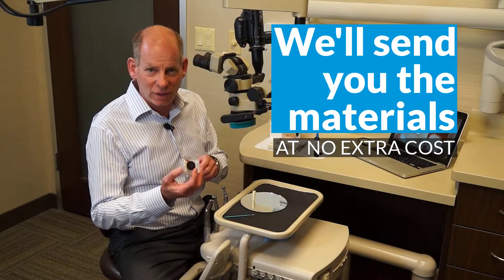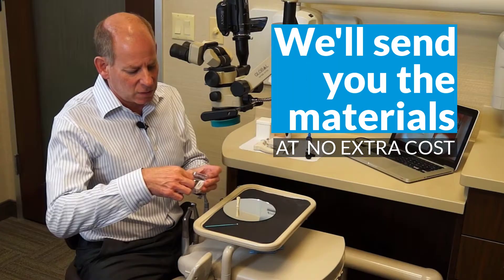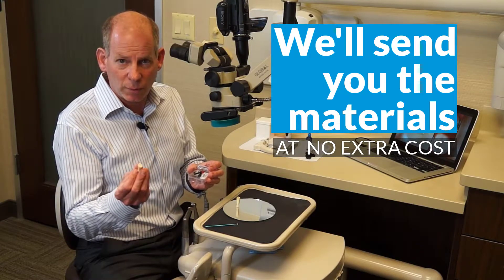You should have all received your little kit. In your kit you'll have your tooth with the occlusal preparation.